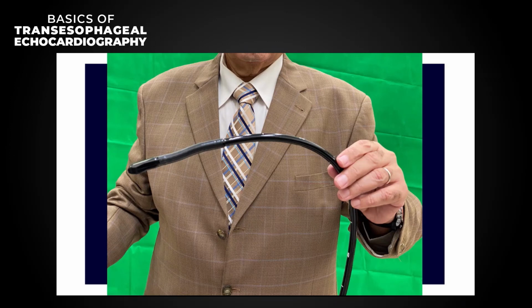The question again: should we perform TEE on all ischemic cerebrovascular events regardless of sinus rhythm? Yes, whether sinus or AF, as I told you. Sometimes you have a PFO in sinus rhythm. So AF, yes, could be a possible source from the appendage.